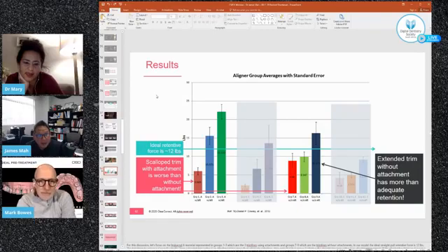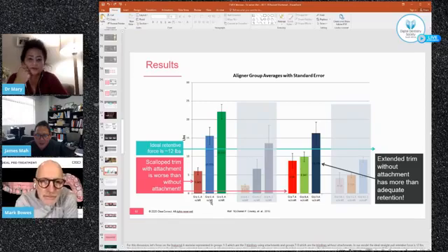And we were quite surprised. If you scallop the trim line and use an attachment, it makes it less retentive. It worsens it. And if you look at the amount of ideal retentive force, which is a straight line pull off of this, it is 12 pounds. If you look at group 2 with attachments, which is a straight line trim, you were above that.